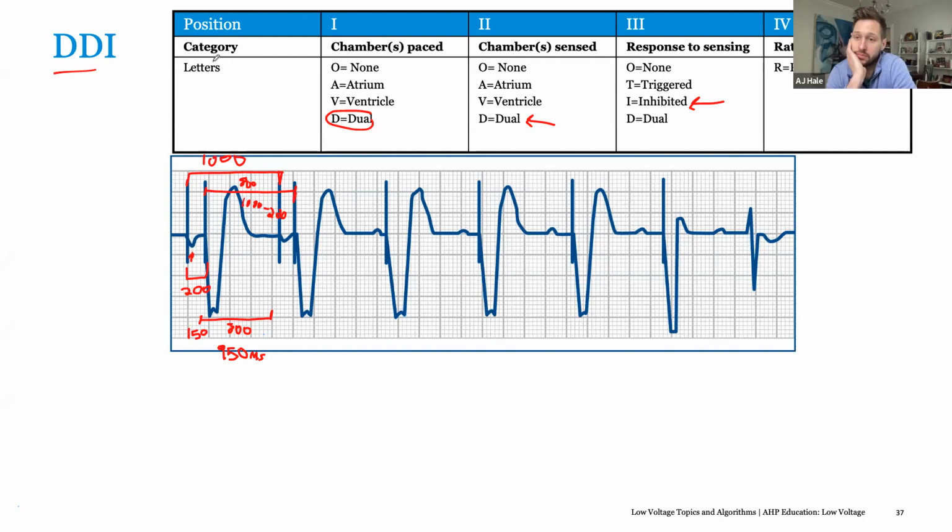If you have 20 patients for pacemaker, you will notice that 19 or 18 of them will have AV block. Then even among the 18 that will have AV block, there may also be one or two among them that will have SA nodal disease. So in this case, when you put this together, what do you recommend?